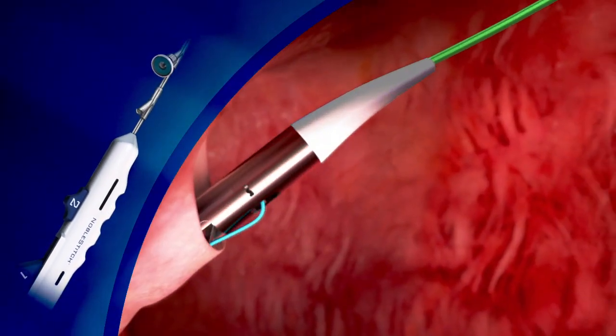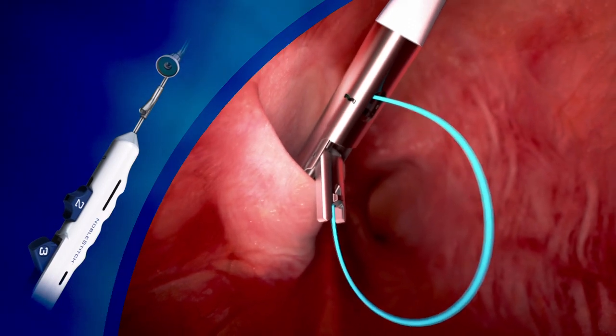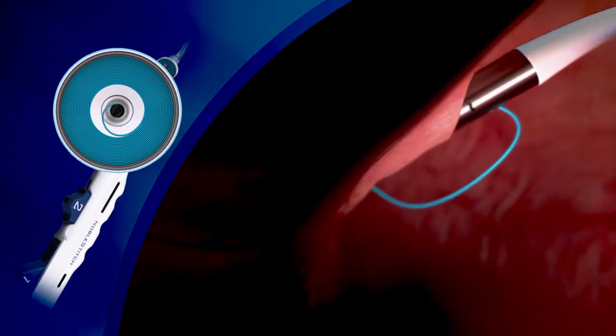Next, the primum device is advanced over the 032 wire into the left atrium. The suture carrying arm is opened and then drawn against the septum primum. The needle is then advanced to pick the suture up, the device advanced forward to clear the primum, and the arm is closed.